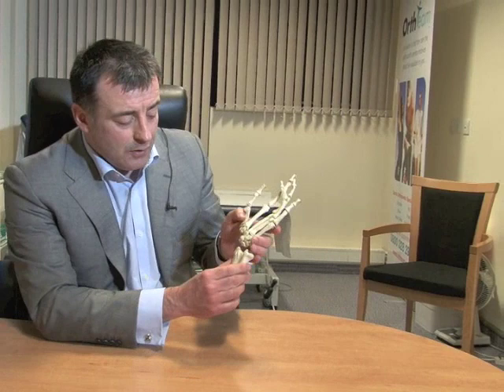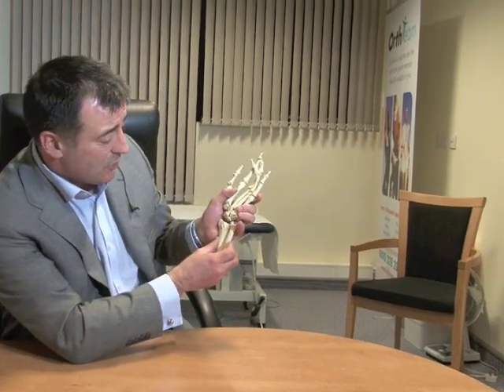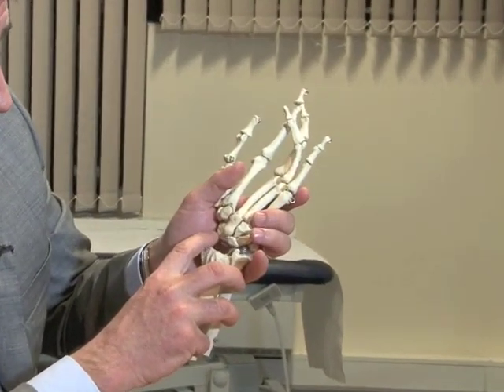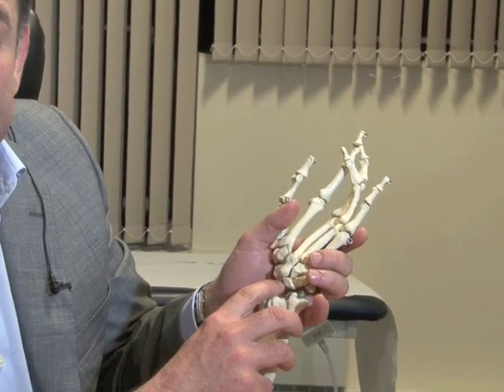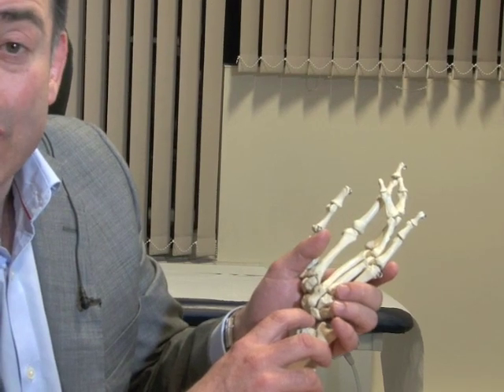There really are quite a lot of bones inside the wrist, which are all tied together. Here's an anatomical model, and during the wrist arthroscopy the camera looks at each of the bones individually and the ligaments attaching them together, and we can often find abnormal movement in cases of trauma.